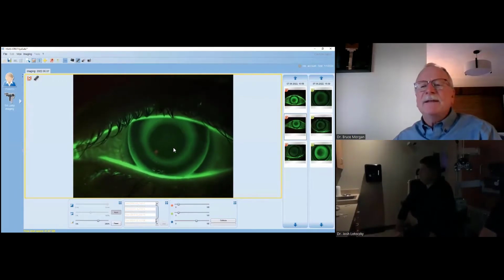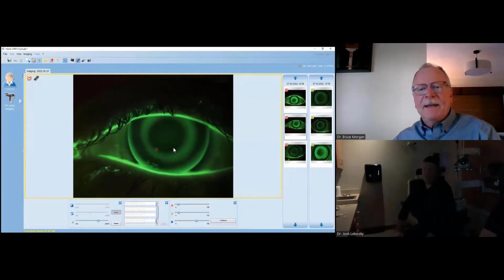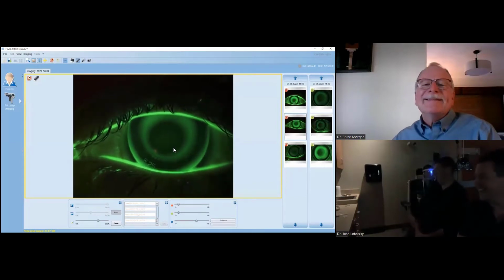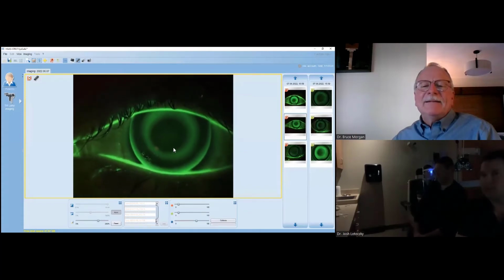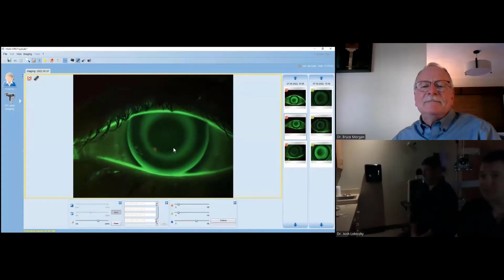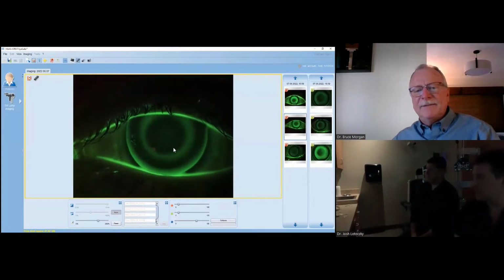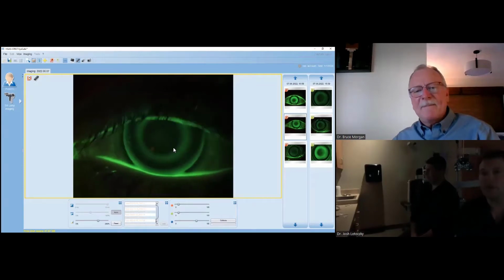But would you dispense that lens if it was day one? Topography shows me after a day or a week. Yeah. If there's anything that you can probably take away so far, it's that we will not just dispense any lens. But no, in this case, it's very possible, because I have patients that look like this, where it looks like maybe it would sit superior, but when they sleep, the lens sits perfectly, and you might adjust yourself out of a fit without ever getting shot.